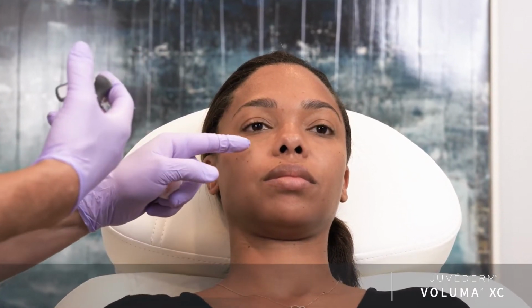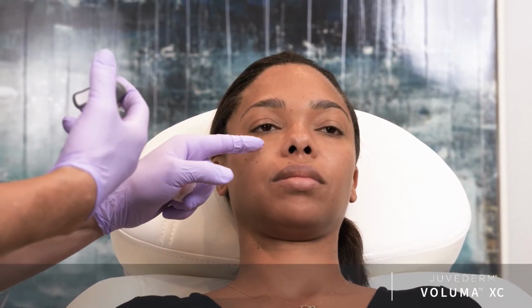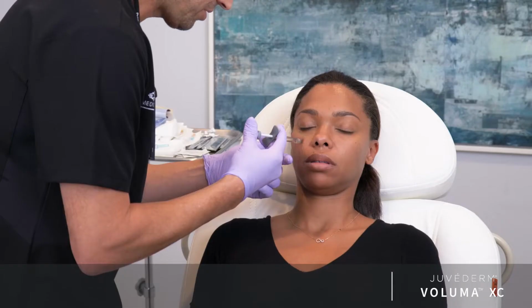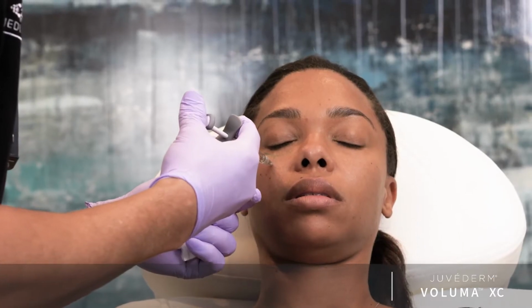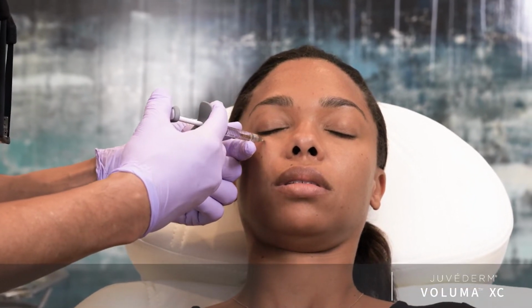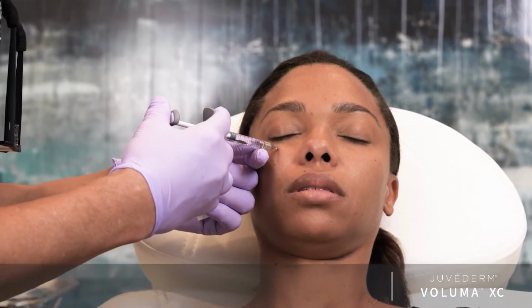I see where the anteromedial cheek has its most concave area, which is right about here. So that'll be my entry point. We know the infraorbital foramen is in this area here, so I want to ensure that I'm down to bone, which means I won't be in the infraorbital foramen. So I'm going to inject 0.2 cc's here. Again, it's against bone. Now what I'm going to do is lift off the bone and reposition the needle superiorly and medially and re-engage the bone.